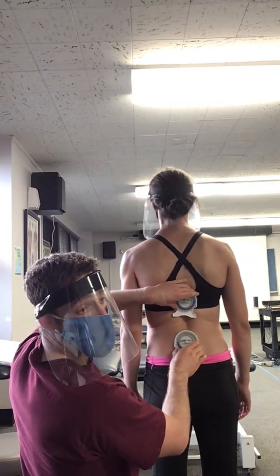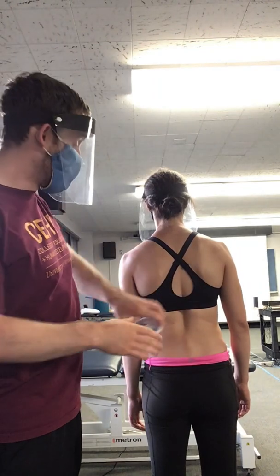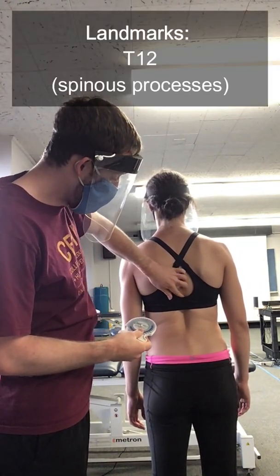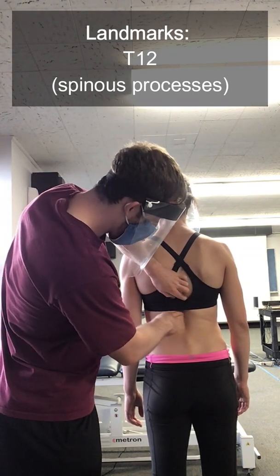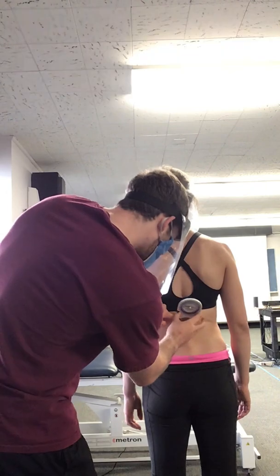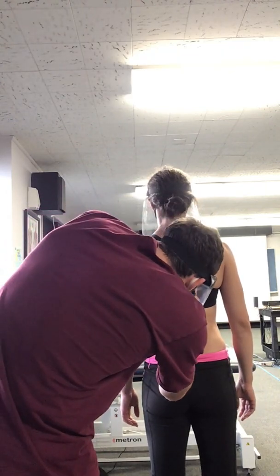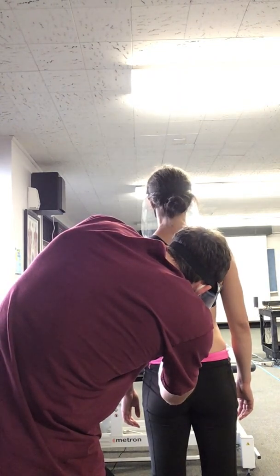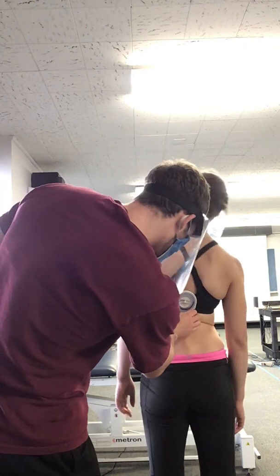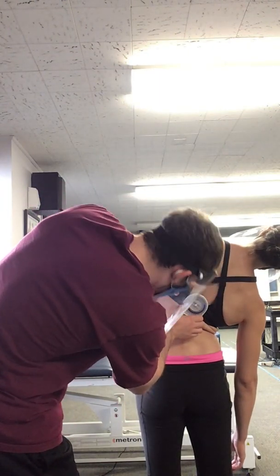So if you don't have two inclinometers and you only have one, you can repeat the exact same process just using the one. Same thing — T7, T8, T9, T10, T11, and T12. I'm going to set it over the spinous processes, make sure it's zeroed out. And then I'm getting 35.